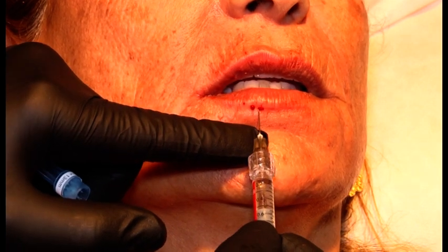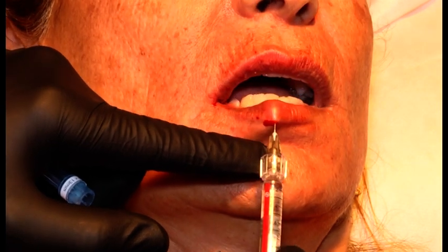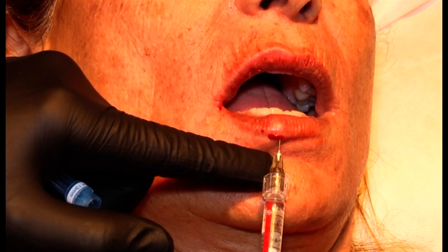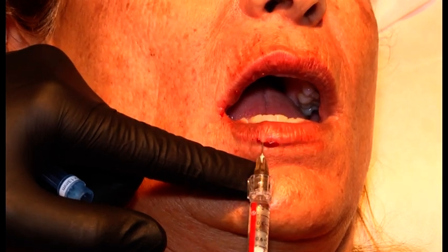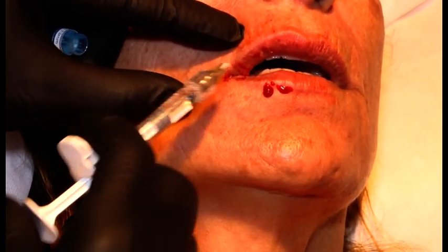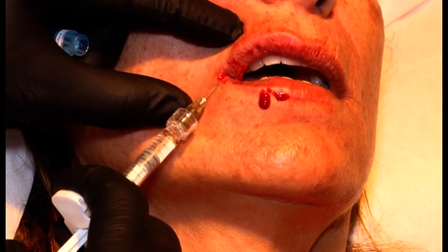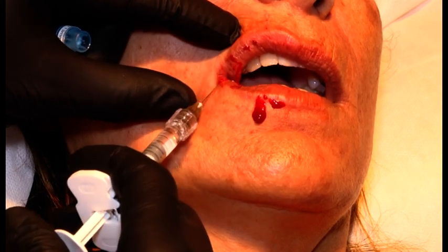Okay, but as an alternative to that standard technique, you can also use this technique, where you advance your needle subcutaneously to the wet-dry border and give a little bolus. And also over here, give a little bolus. And also over here, give a little bolus. So for the lower lip, we focus on the medial part. The upper lip, we also go down to the oral commissure, and of course that is also where we want to create a little bit of extra lift to have that nice secret smile.